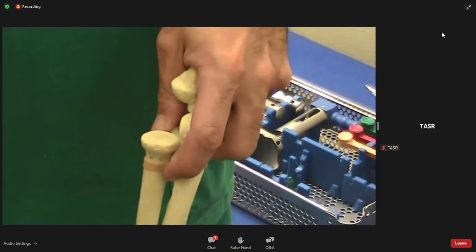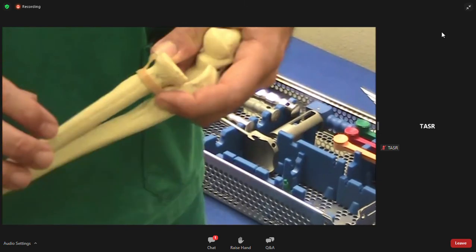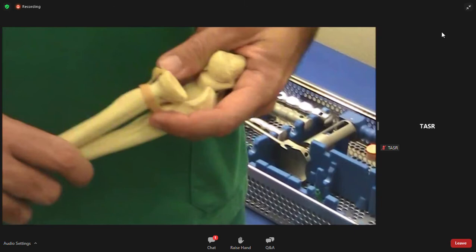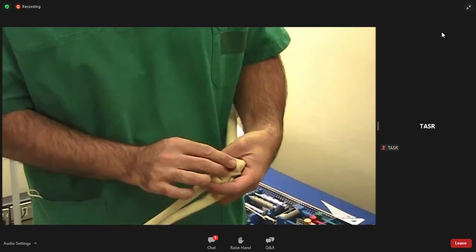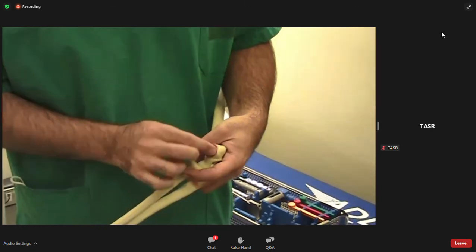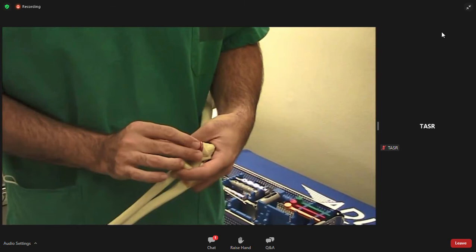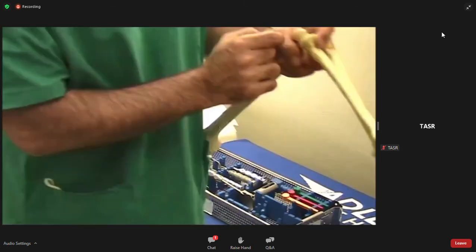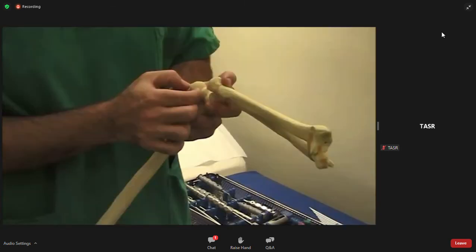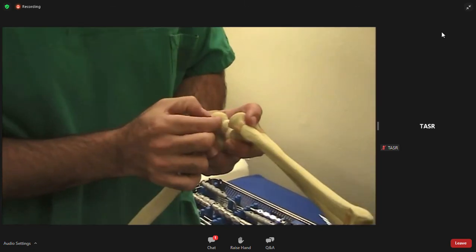The second test you can do is to take the prosthesis and to put it over the capitellum and to understand the amount of congruity that you have of the 2 and to have an idea of the dimension. The third one is to take the diameter or the dimension of the medial to lateral capitellum, and that's another very nice instrument.